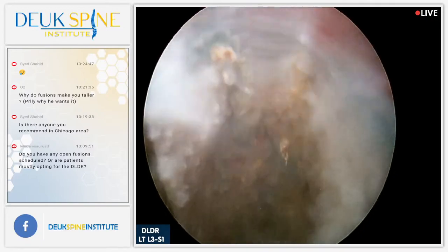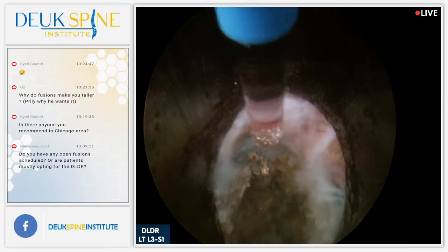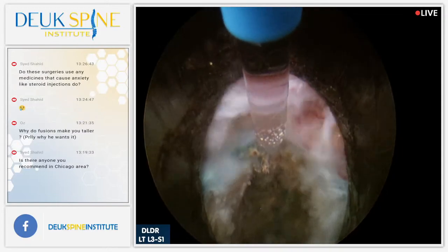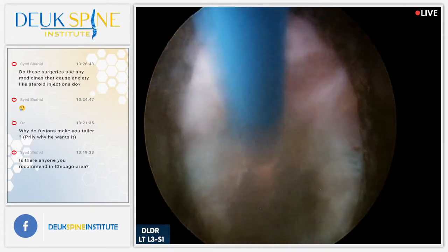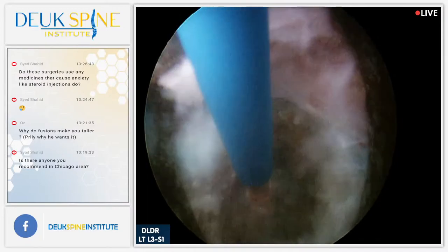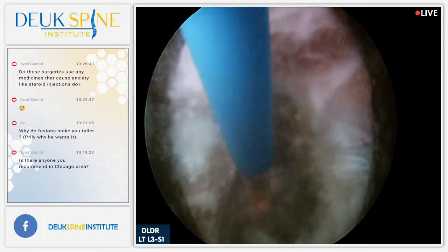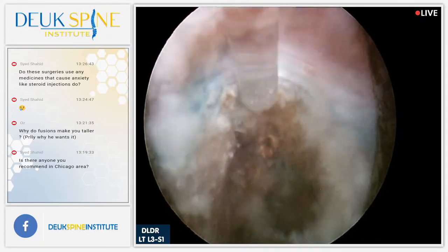We don't want to be doing surgery to make people taller. That's nonsense, okay? But the reality is, if you put enough cages in the discs, then you're going to make the person taller by lengthening their spine. Now, the amount of lengthening of the spine they're getting is negligible. There is one more effect, and that is straightening of the spine.